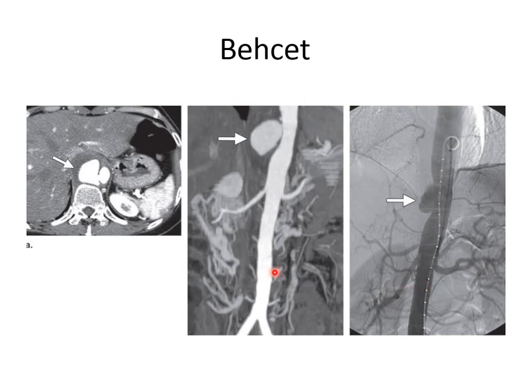Another entity, which is a non-infectious cause of aortitis, is Behcet. Behcet disease, of course, is a chronic relapsing systemic disease of unknown etiology. It causes mucocutaneous ulcers and affection of large vessels, mainly the aorta. An important point is that Behcet causes saccular aneurysm, not fusiform, because in Takayasu and giant cell we see it as fusiform. Behcet can cause fusiform, but it may cause pseudo or saccular aneurysm.